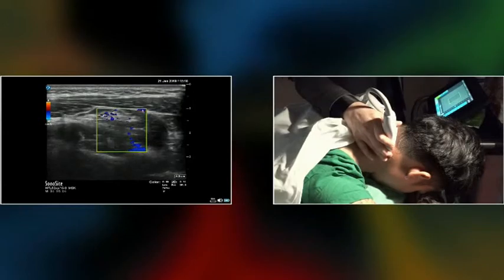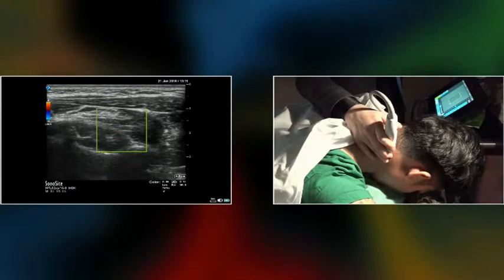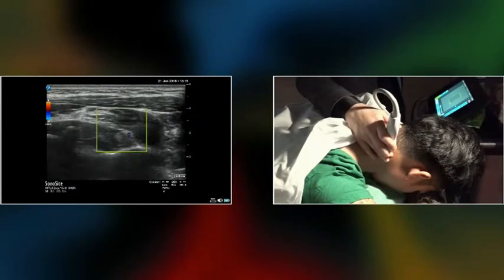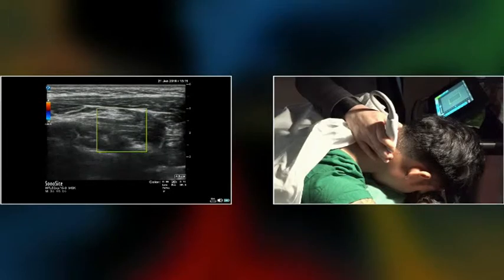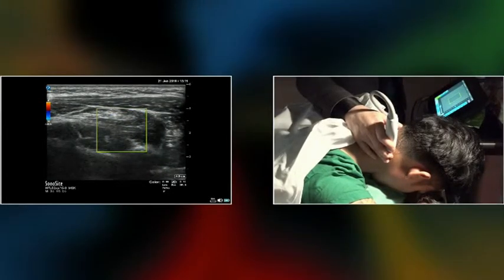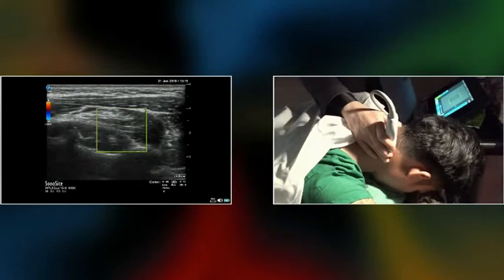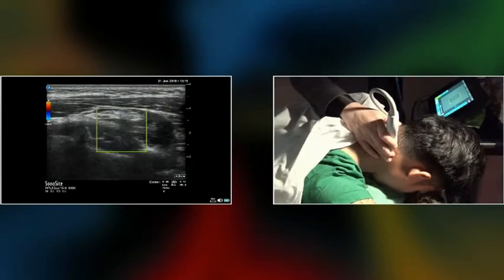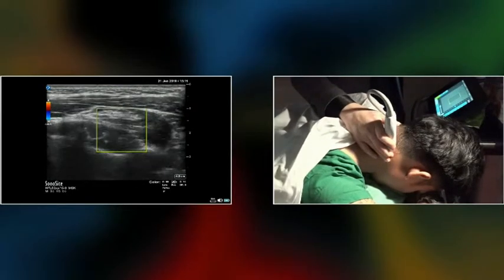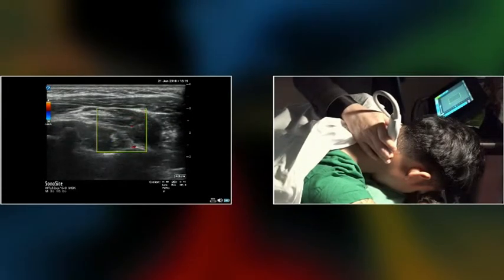to see between, you can see the Doppler signal of the occipital artery. The nerve sometimes, in different people, depends on the echogenicity of the muscles. So you can see this man, actually his capitis muscles have some stick of fibrosis and hyperdensity. So that will exactly block some of the signal that you can see with the Doppler.